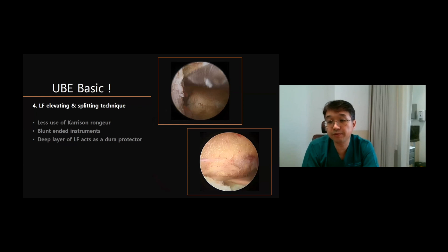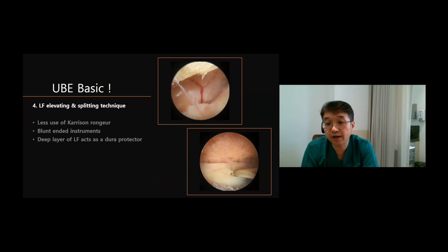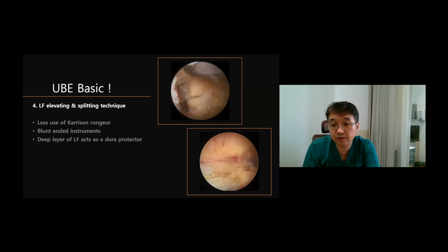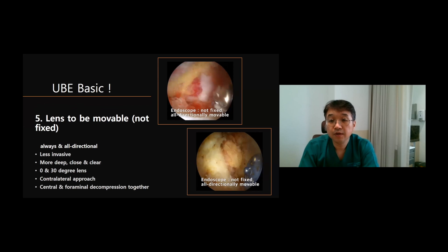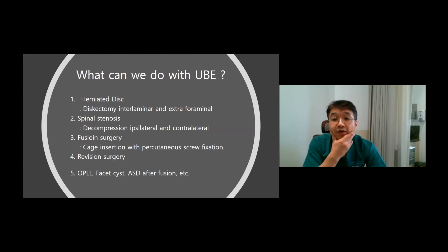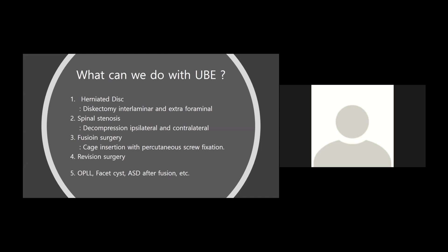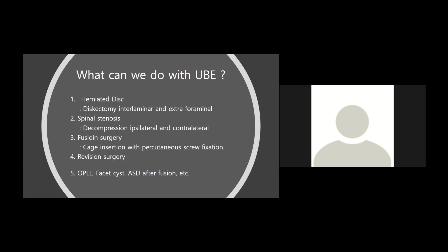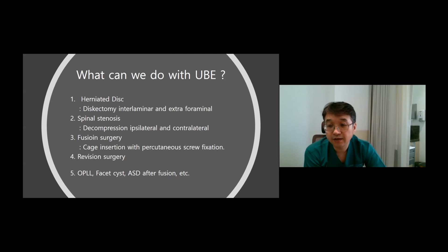Next is the technique to remove the ligamentum flavum. Using a blunt instrument, split the ligamentum flavum and with a Kerrison rongeur, remove the ligamentum flavum safely. Minimal touch of the dura is very important. The scope can be moved in all directions for a deeper, closer, and clearer view. As a surgeon's convenience, we can use variable degree lenses. What can we do with UBE? I think all kinds of spine diseases can be treated by UBE: herniated disc, spinal stenosis, fusion surgery, revision surgery, OPLL, facet cyst, and so on.